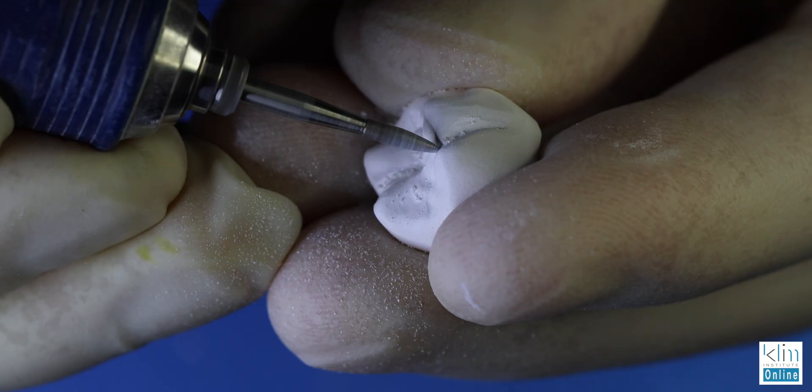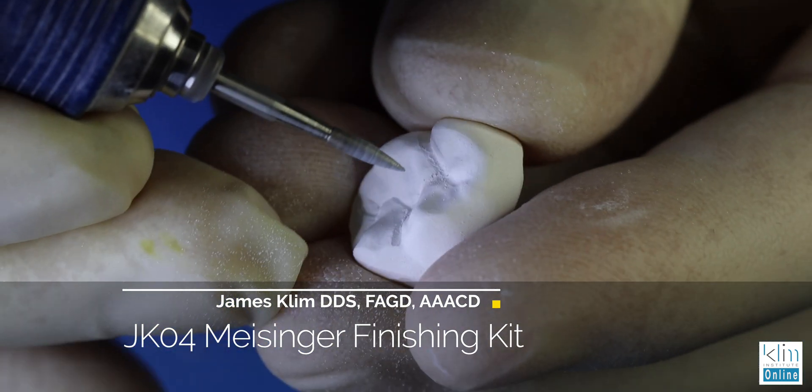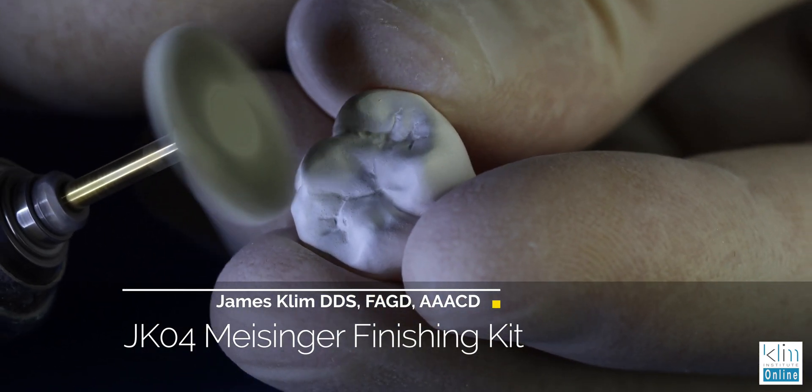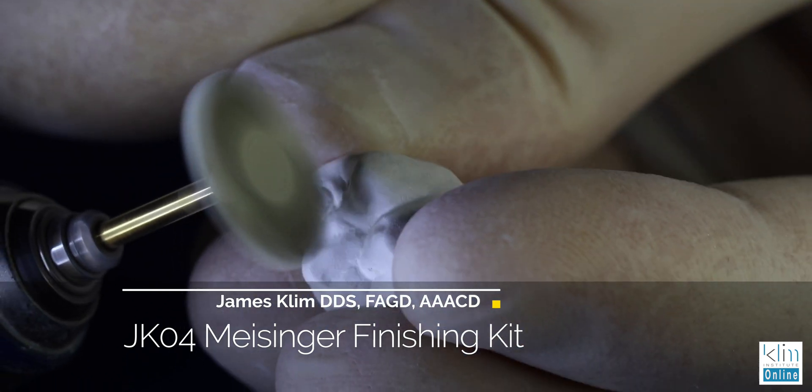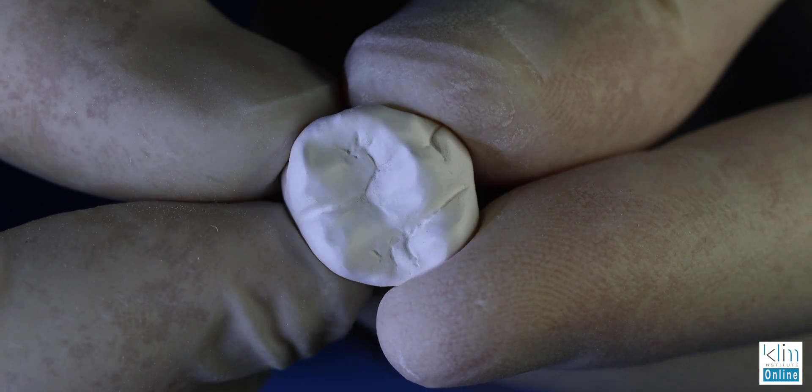The other thing I find nice about the Prime Mill is that the mill is smoother than the dry mill with the M6L — I have both milling units. As a result, once your restoration comes out of the milling unit it's a lot faster to finish. All I do is refine the occlusal table a little bit more where I want those grooves to look just right, and polish the actual surfaces using the JK04 Meisinger finishing kit made just for zirconia.